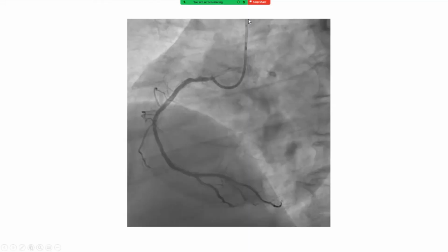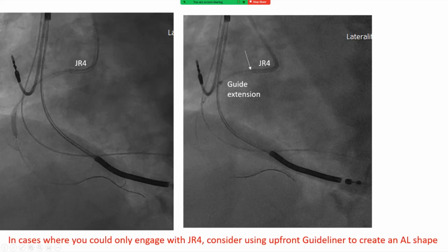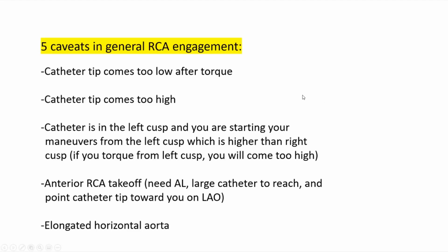This is an illustration of an Ikari Left 4 that we pushed to make it like an Amplatz Left 1, but an Amplatz Left 1 that is barely engaged, not deep elongated. So it's very versatile in the way you can use it. Keep in mind, like with any general RCA engagement, those 5 caveats that I explained in the past and that I will explain again in another talk.